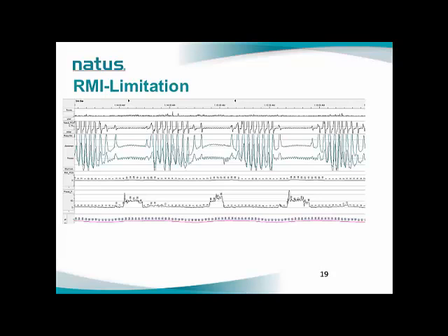However, due to the physiological cardioballistic oscillations represented as small humps during the absent effort period, the phase shows that there is a change in the phase signal. Therefore, associated RMI events were detected. This is the only limitation of the RMI.